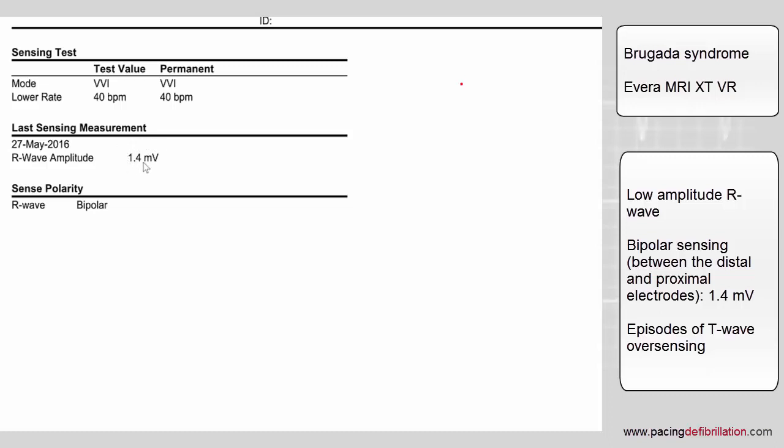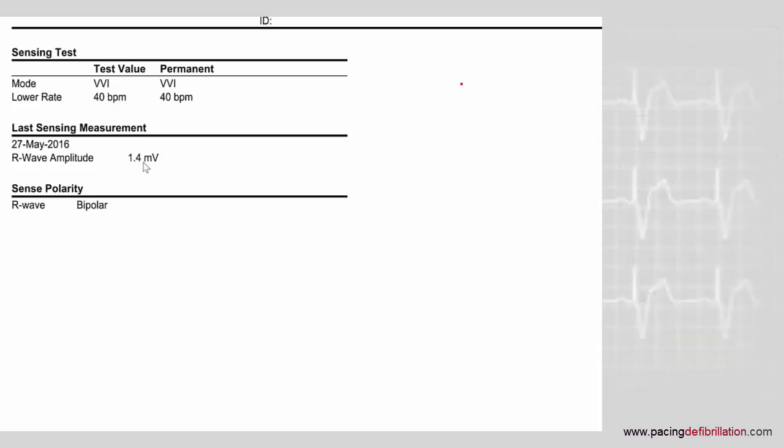In this case, the possibilities of reprogramming are limited. Indeed, there is no possibility in Medtronic devices to reprogram the upper threshold, the decay delay, or the filters.